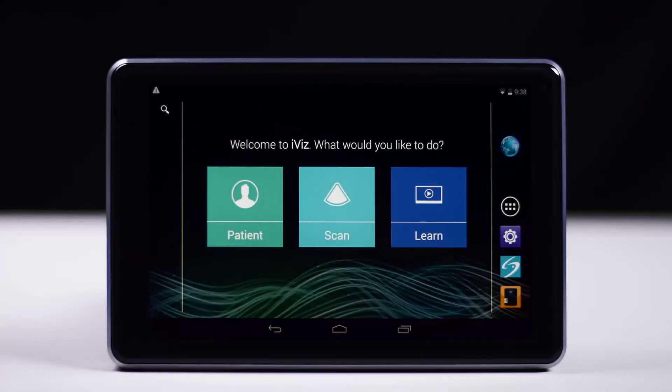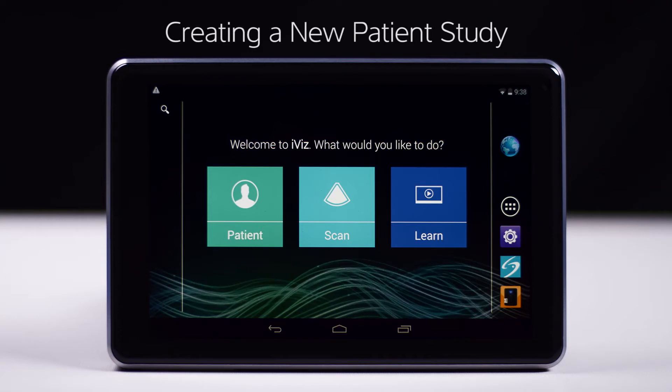Welcome to the help video on Creating a New Patient Study. In this video, we will show you the different ways you can start a new patient study using iViz.